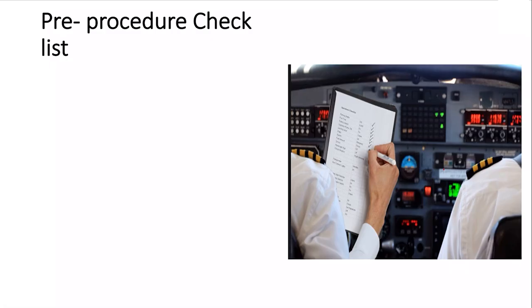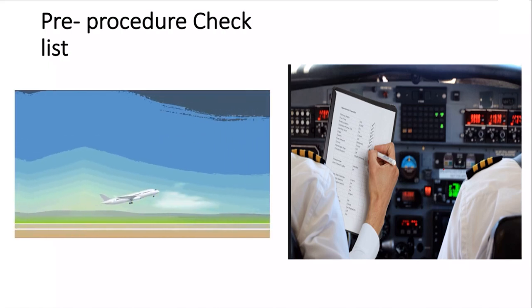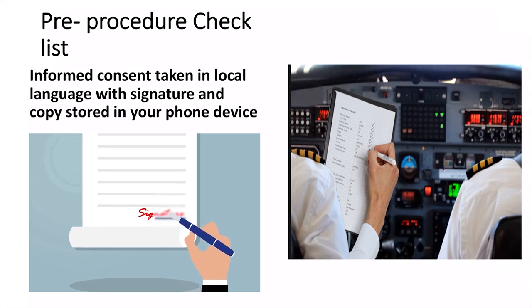Now coming to the pre-procedural checklist, just like when you board a flight, you see pilots doing a last minute check of the aircraft. Similarly, you need to ensure that the informed consent of the patient has been taken in the local language with the signature of the patient, and a copy of this should be stored in your phone device.